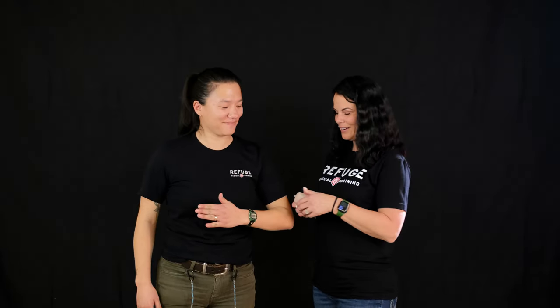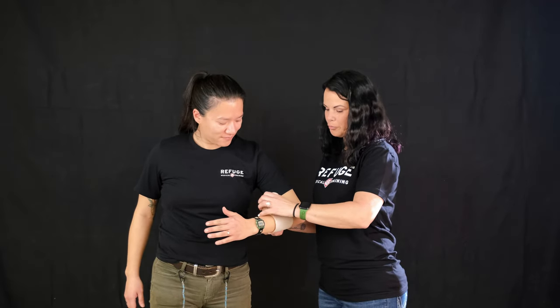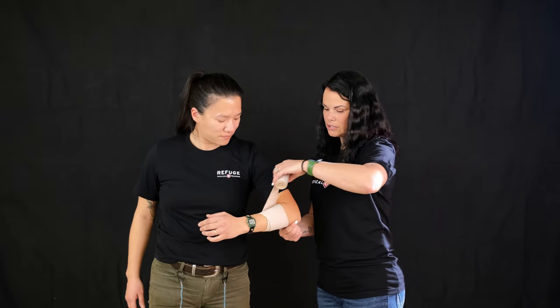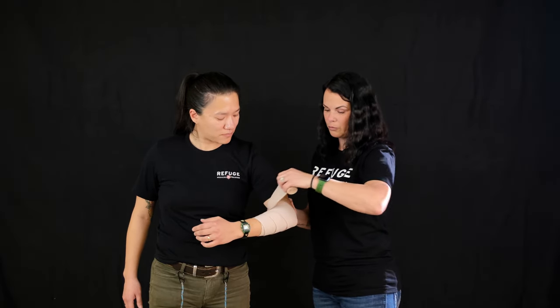So at this point we're going to use Hannah's elbow. You're just going to start here and begin wrapping, putting gentle pressure on there so that as you wrap it's going to give you stability. Whenever she uses her elbow it'll help stabilize it.